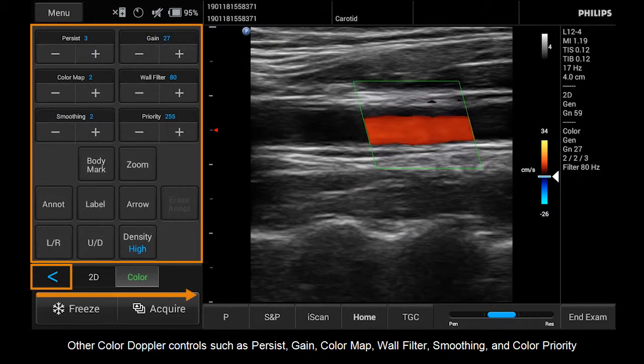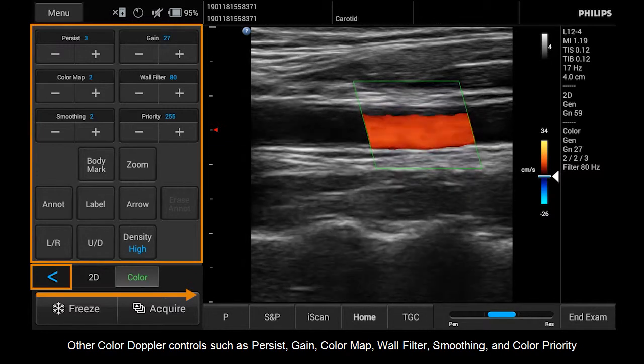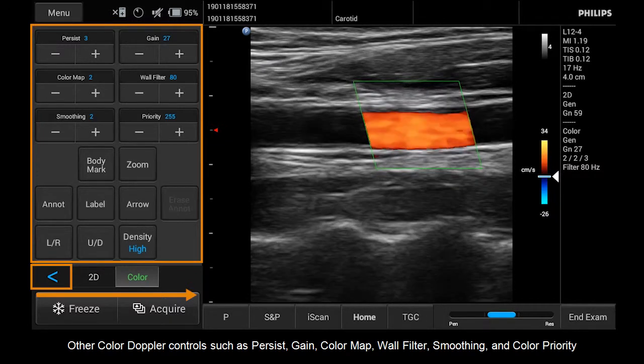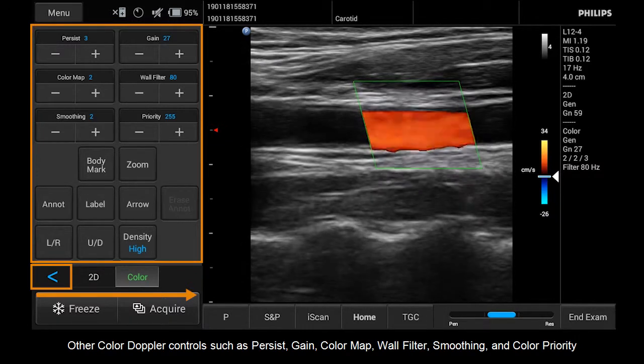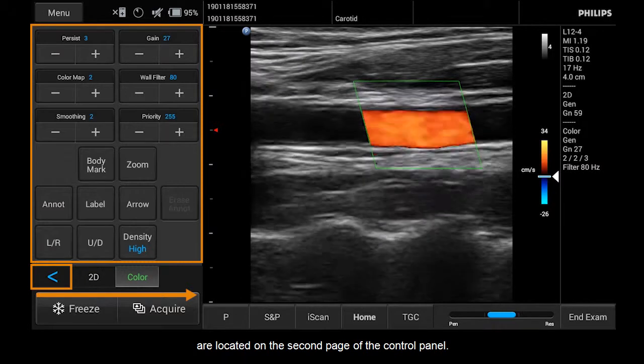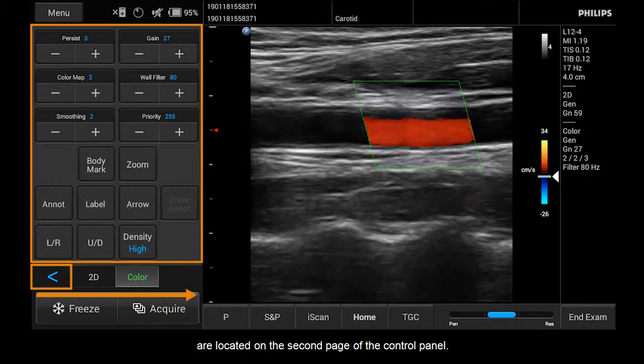Other Color Doppler controls such as Persist, Gain, Color Map, Wall Filter, Smoothing, and Color Priority are located on the second page of the Control Panel.